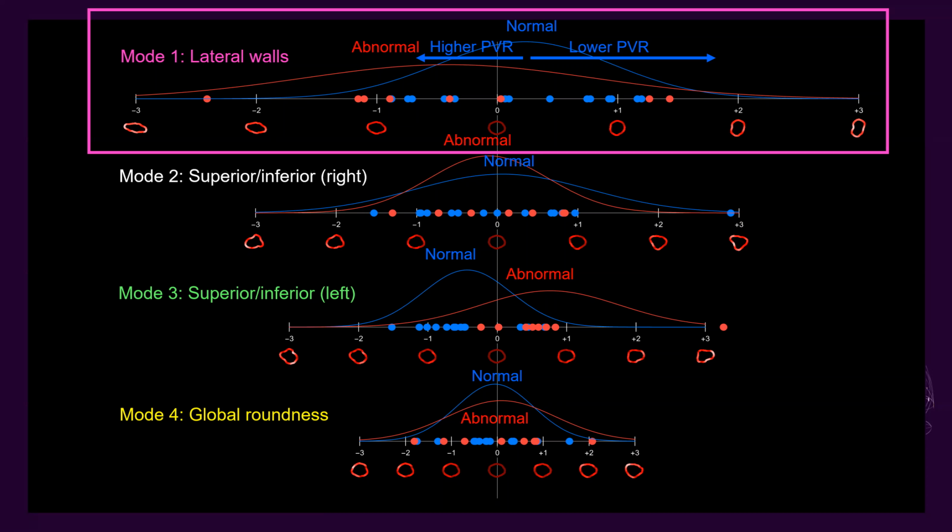And radiographically normal appearing bladders with shapes less similar to radiographically abnormal appearing bladders were less likely to be associated with increased post-void residual volumes, or alternatively, more likely to be associated with decreased post-void residual volumes.